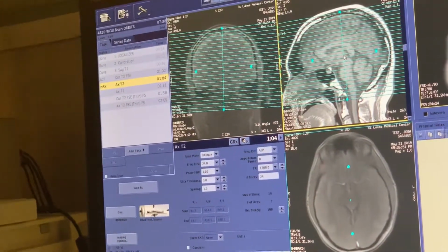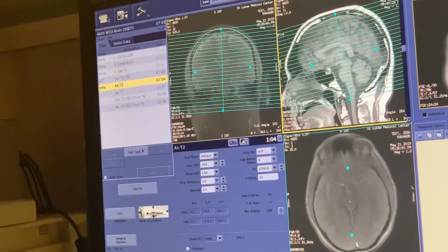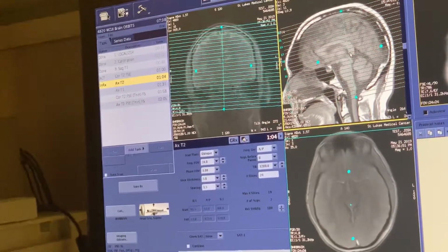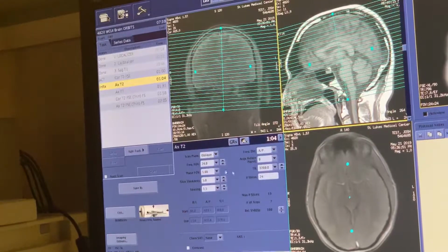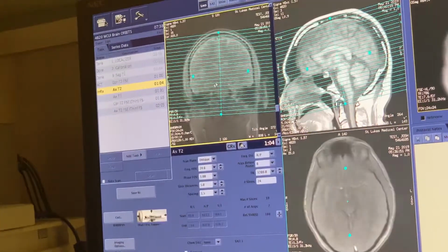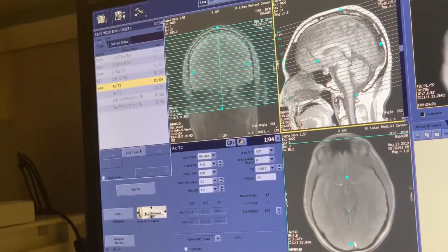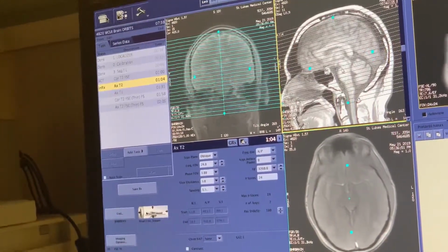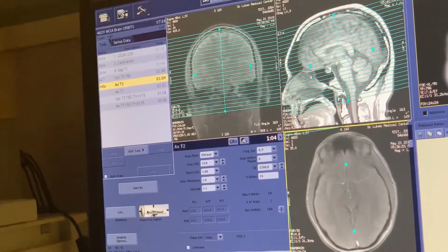Because it's an axial, I'm going to throw down in the sagittal plane. I'm going to angle with the posterior aspect of the brainstem like that. Very good. I'm going to angle here. Oh, I threw down. I just want to make sure that the slices are going the correct way, which they are. All right, and then angle in all 3 planes.